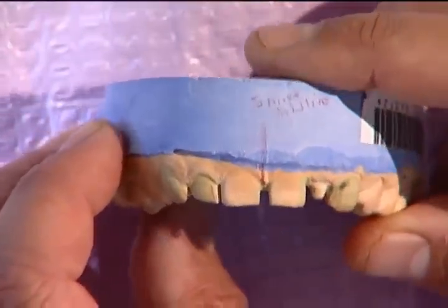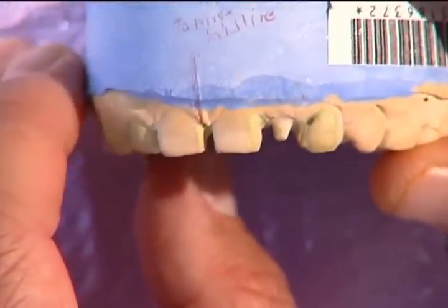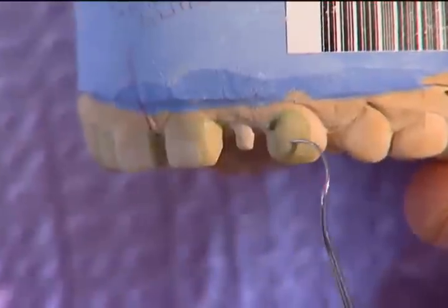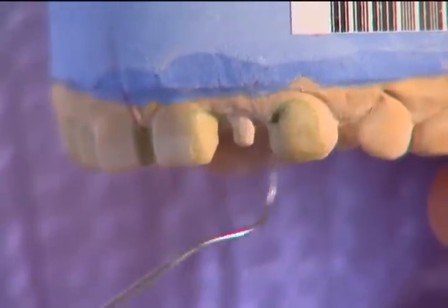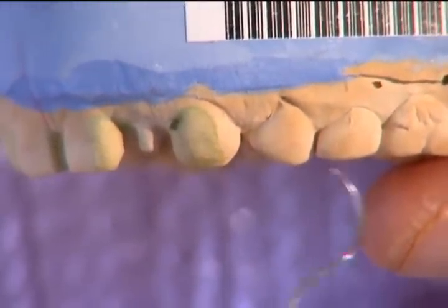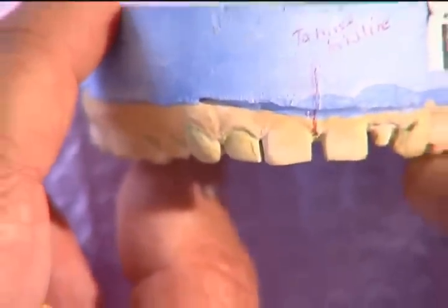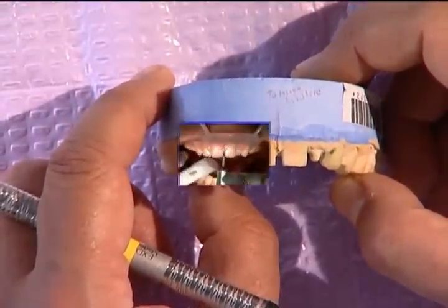In some cases you could receive a model prepped further incisally. Looking at tooth number 10, they did in fact prepare a full crown — necessary to correct the anterior crossbite. Looking at tooth number 11, they prepared about two-thirds of the way over and left the distal third alone, which is common. The veneer covers the entire tooth but reduction is only needed from the mesial half of the facial surface. Unless the cuspid is really rotated with the distal half kicked out, you don't need much reduction there. The other bicuspid needs no preparation — it's a no-prep veneer. The three adjacent teeth are PFMs with porcelain already on them. For a minimal prep case like this, the prep guide gives a clear picture of where to prep, and anywhere the models aren't marked, I don't prepare at all.